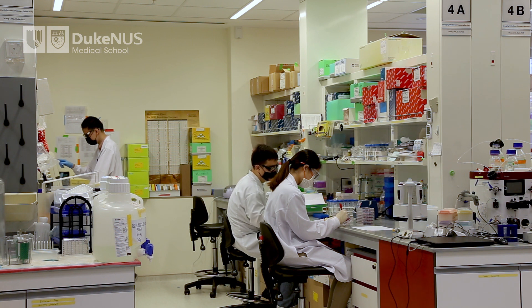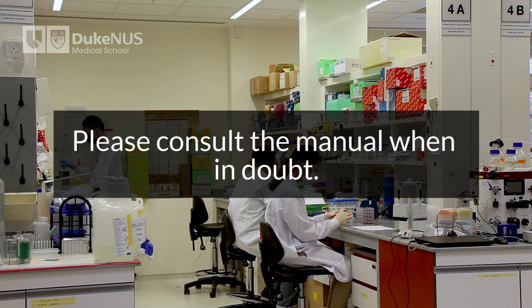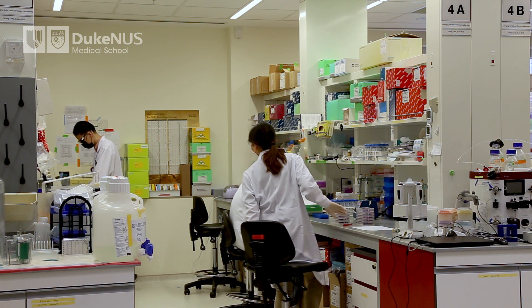This video is not meant to replace the instruction manual that comes with every kit. Please consult the manual when in doubt. The content of this video is mainly based on this manual.